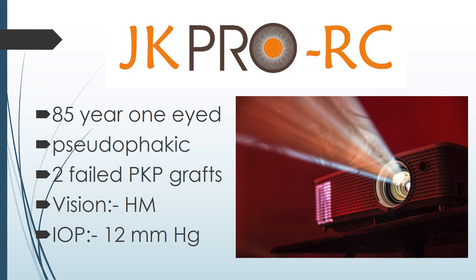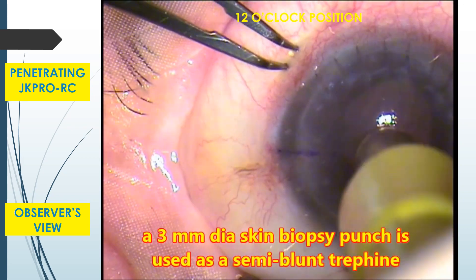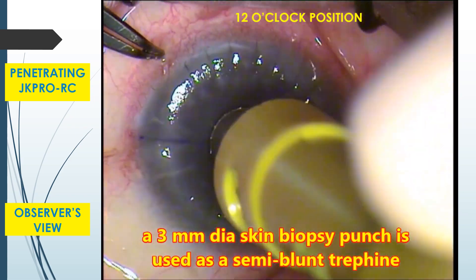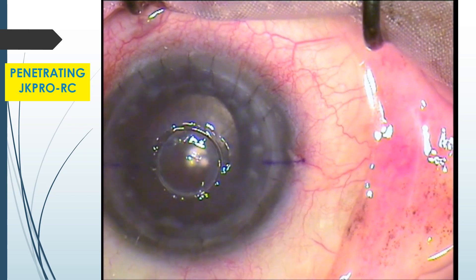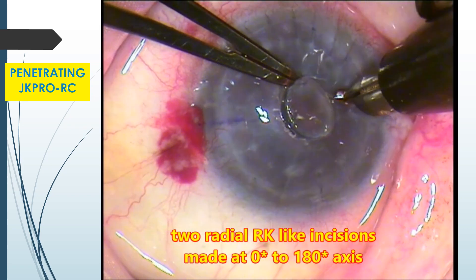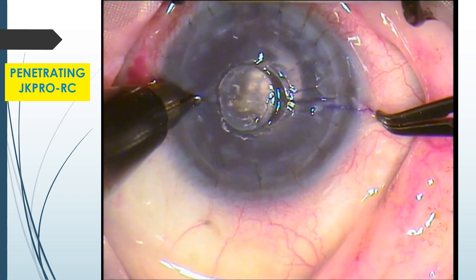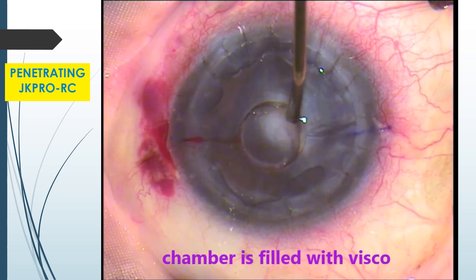Let us see a video of JK Pro RC implantation in an 85-year-old one-eyed pseudophakic patient with two failed PKP grafts, whose vision was hand movements and IOP was 12. A 3 mm diameter skin biopsy punch is used as semi-blunt trefine for partial thickness and non-perforating trefination. Two radial RK-like incisions are made at 0 and 180 degree axis. After perforating the cornea with a pointed knife, the chamber is filled with visco.